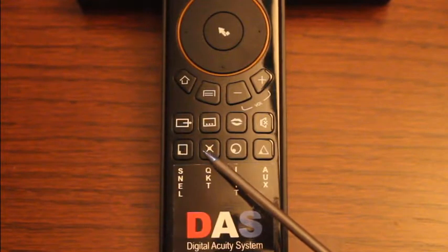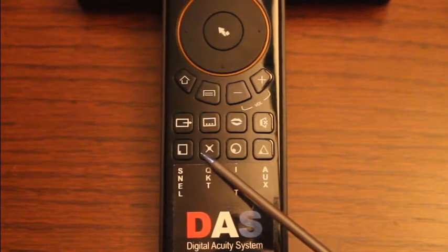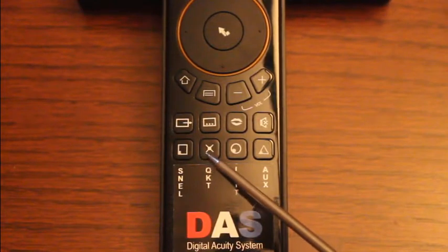If you press it once, you get a very simple contact lens follow-up acuity test that shows acuities from 20/40 to 20/25 with only 3 Snellen letters per line. If you feel the patient can handle 20/20, simply arrow down, or arrow up if they fail 20/40.